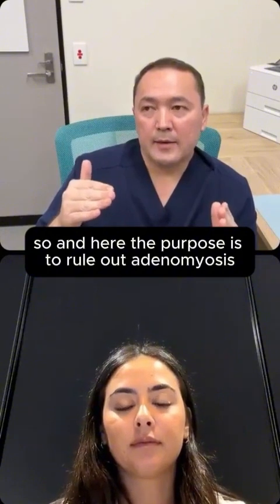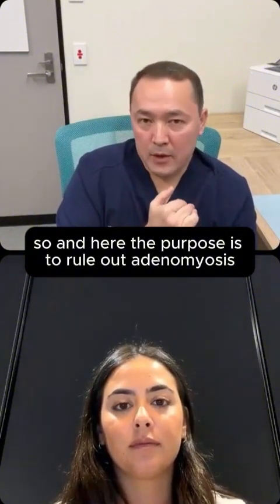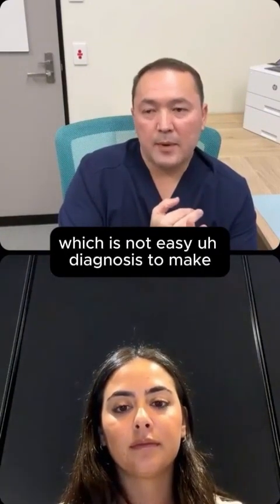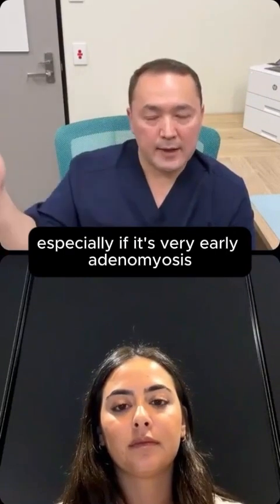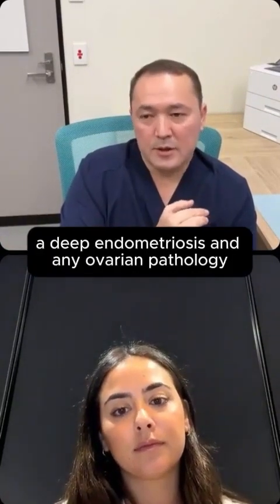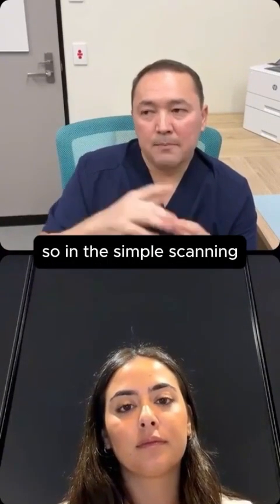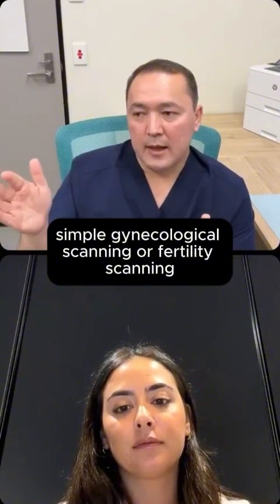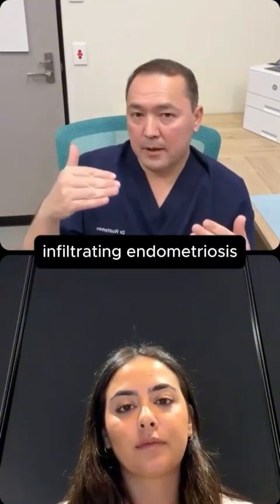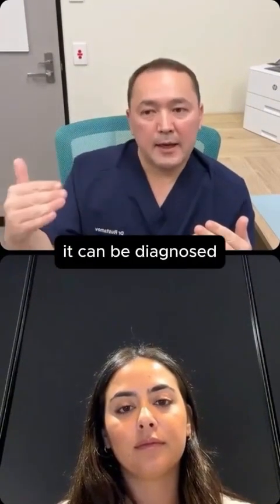Here the purpose is to rule out adenomyosis, which is not an easy diagnosis to make, especially if it's very early adenomyosis, deep pelvic deep endometriosis, and any ovarian pathology. In simple gynecological scanning or fertility scanning, you may not be able to diagnose deep infiltrating endometriosis, but in deep pelvic scanning, it can be diagnosed.